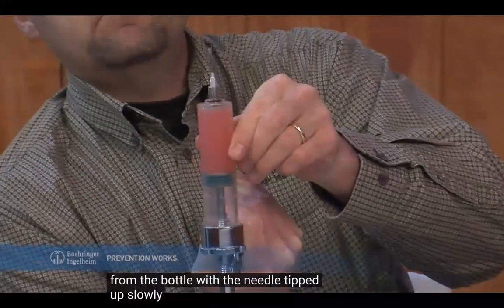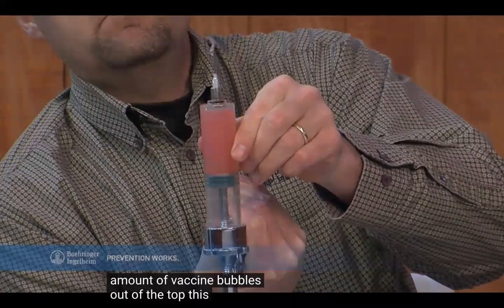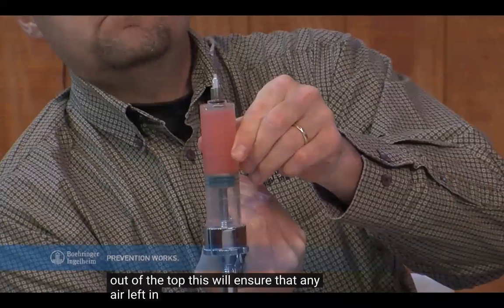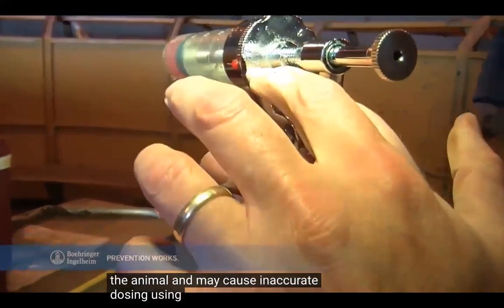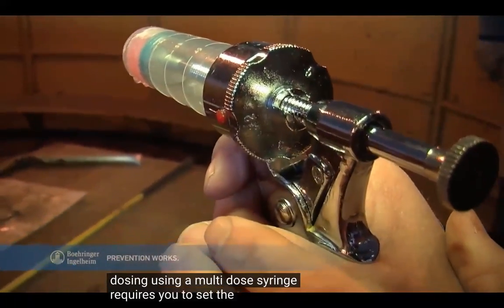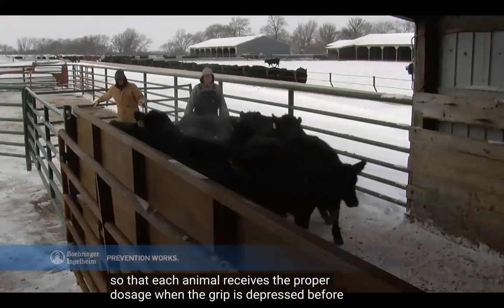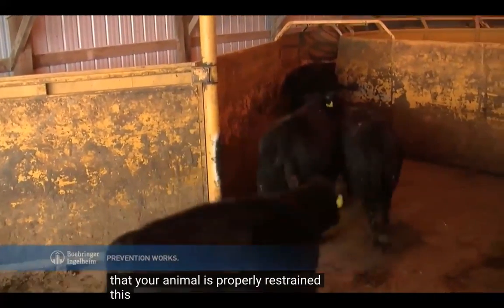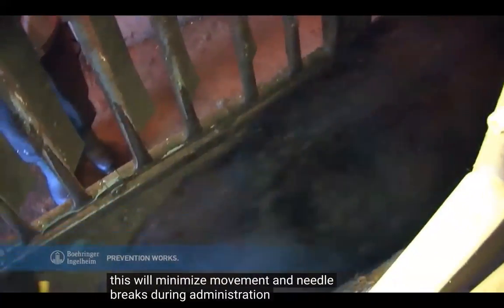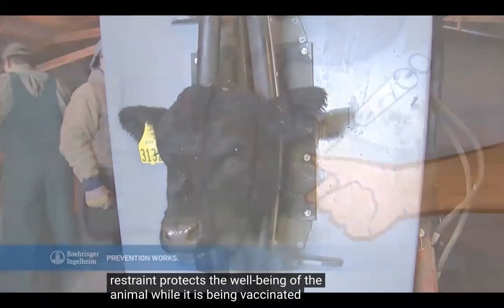With the needle tipped up, slowly push the plunger until a small amount of vaccine bubbles out of the top. This will ensure that any air left in the syringe or needle is gone. Air in the syringe is dangerous to the animal and may cause inaccurate dosing. Using a multi-dose syringe requires you to set the correct dosage so that each animal receives the proper dosage when the grip is depressed. Before administering your vaccine, make sure that your animal is properly restrained. This will minimize movement and needle breaks during administration. Proper restraint protects the well-being of the animal while it is being vaccinated.